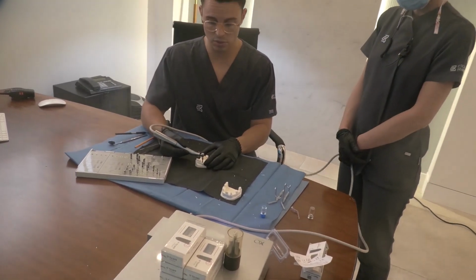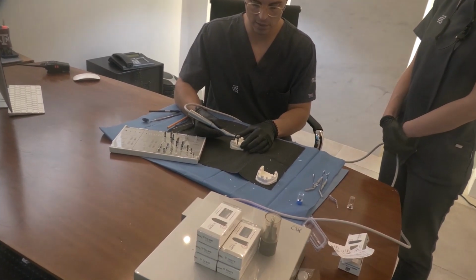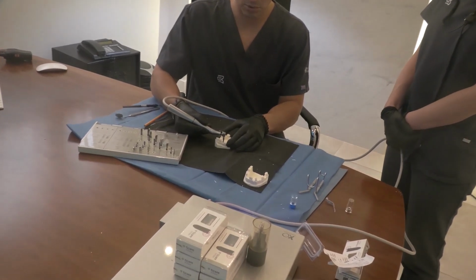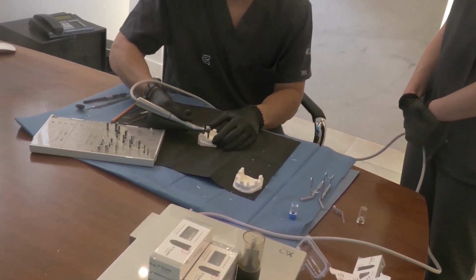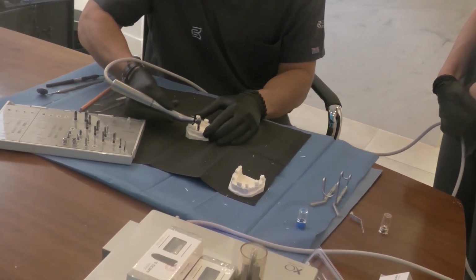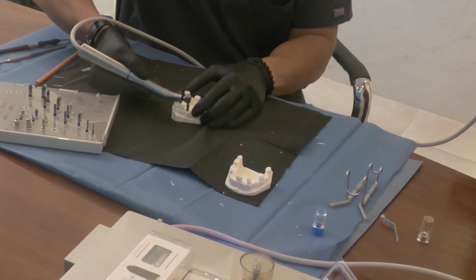Now with no irrigation whatsoever, and it's time for the implant to be positioned in the ideal position, and also considering that the drilling has been appropriate in terms of sequence. Now we can slightly submerge it about 1 millimeter subcrestally.